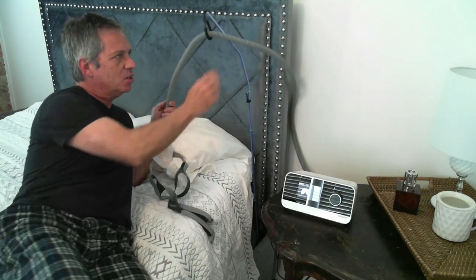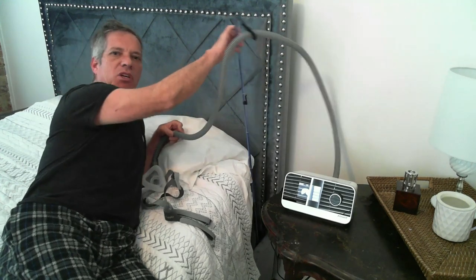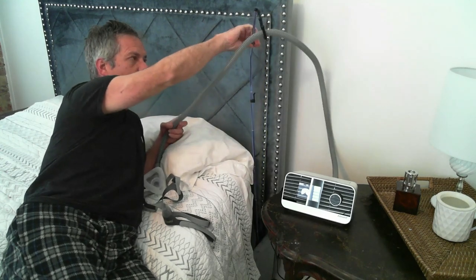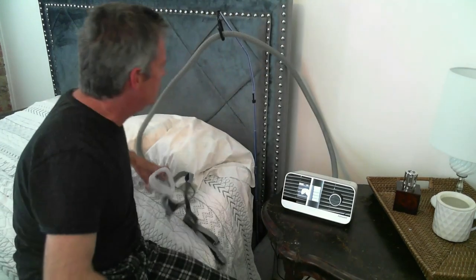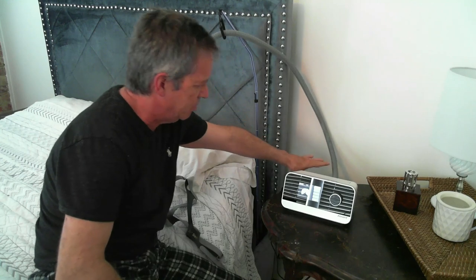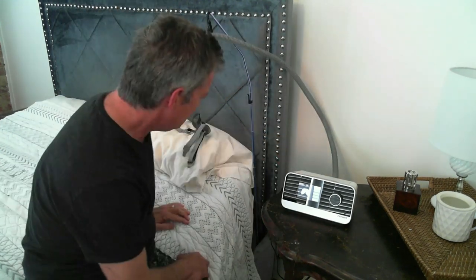You can roll to your left side or your right side with ease, and you can feed the tubing through easily. It gives, but it's supposed to give so that it can go with the flow of the tubing. The coolest thing is that there's no low dip in the tubing, so if there's water in the tubing it's not going to run back to you — instead it'll run back into the heated humidifier.